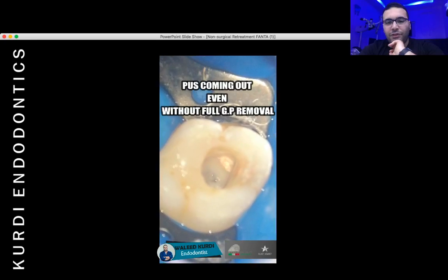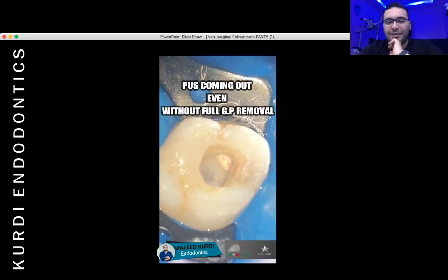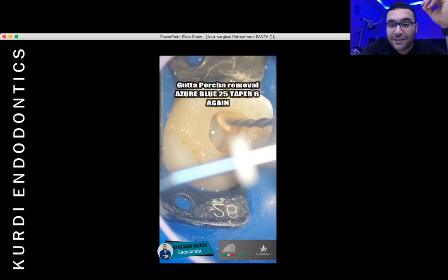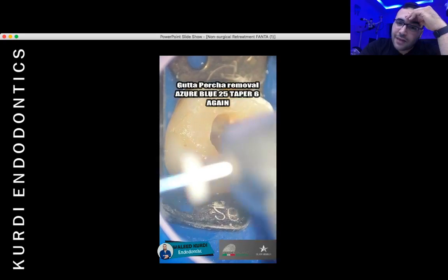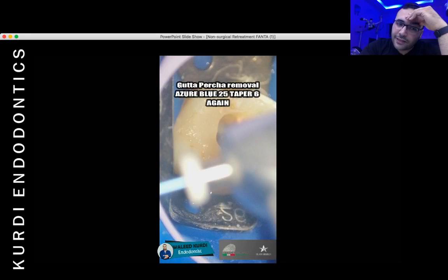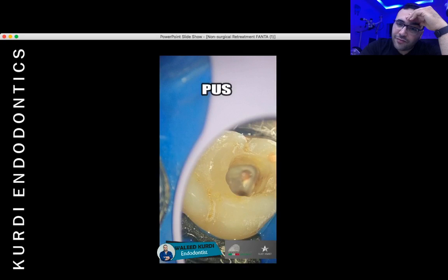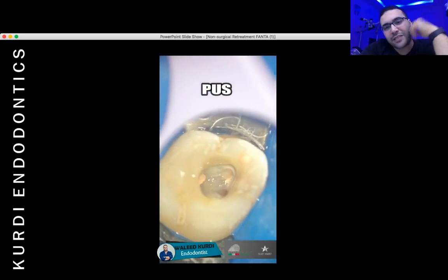Just enjoy the video, and I just save my voice a little bit. You can see the pus coming out from inside the canal. With some gutta-percha removal, I started to have more pus coming from inside the canal.